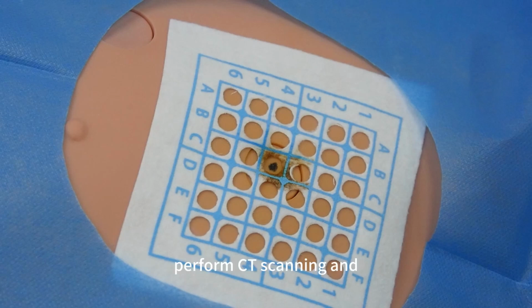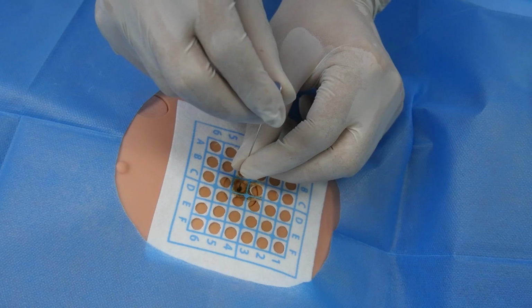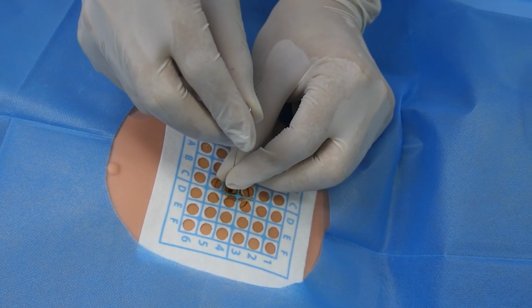5. Perform CT scanning and reconstruct the surrounding left and right levels. Combine with the positioning patch in CT images. Choose a suitable puncture point on the body surface. Mark it with a skin marker pen.